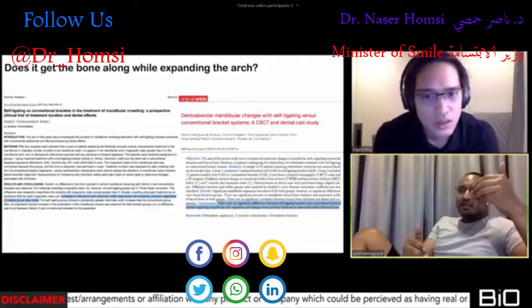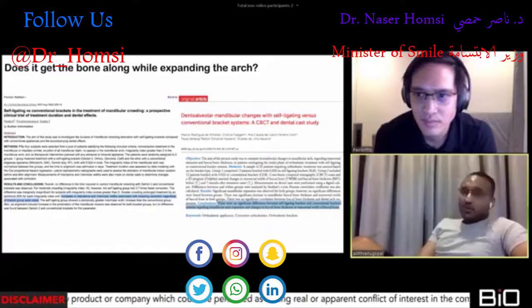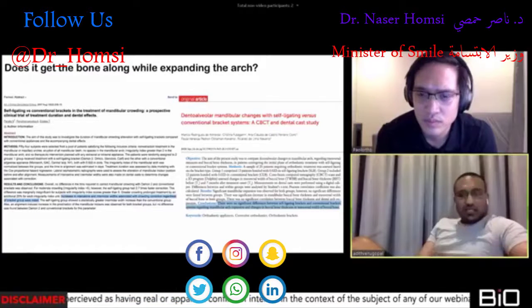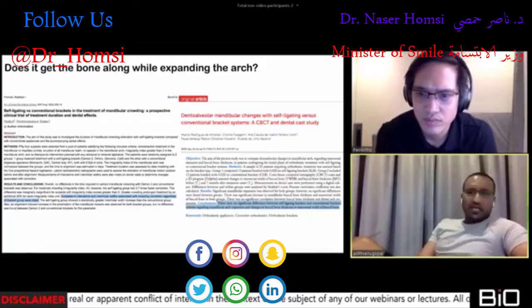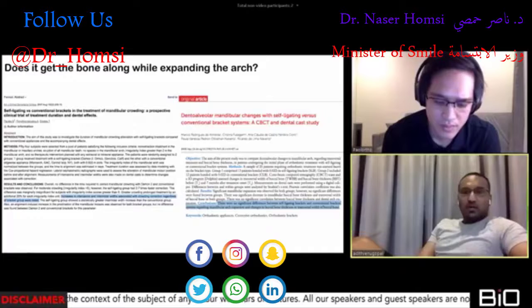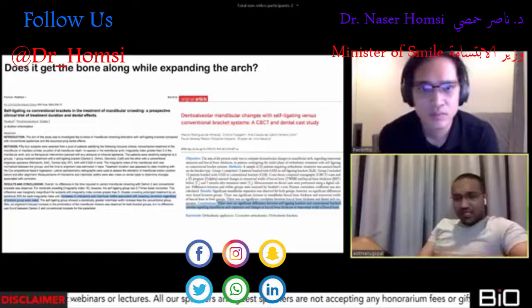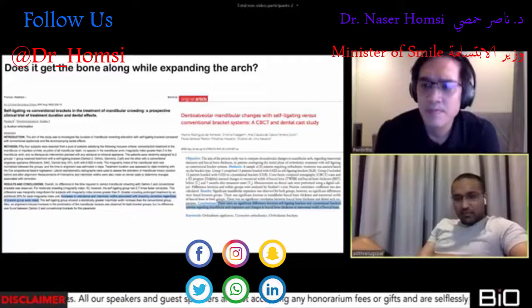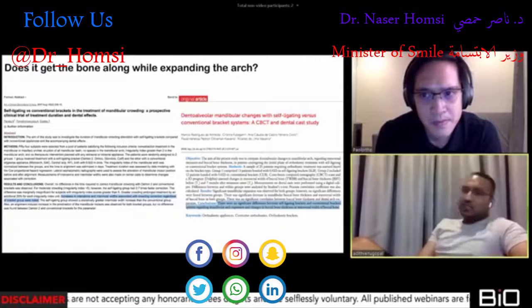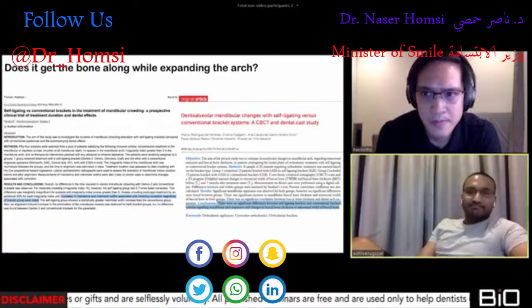So a lot of evidence is still needed. We can't debunk the fact that Damon is falsely claiming such things. There may be, but I would really urge people to come out with CBCT studies to prove very clearly that it's not just dental tipping. It's more of bone along with tooth expansion. The only way you can claim or debunk that myth is by proving it with X-rays, with CBCTs, otherwise it makes no sense.